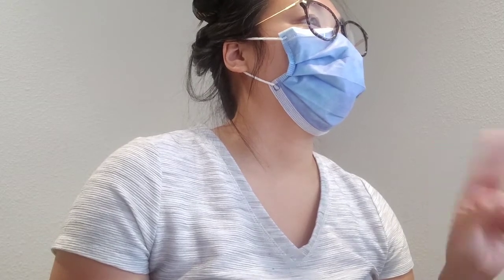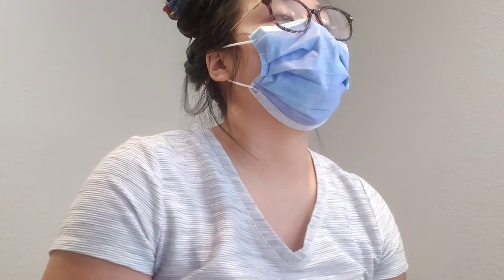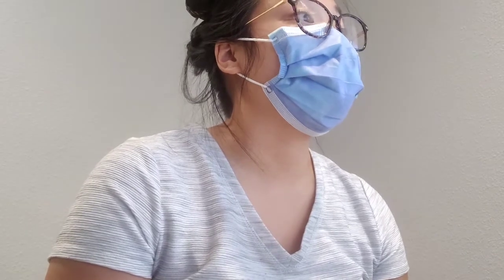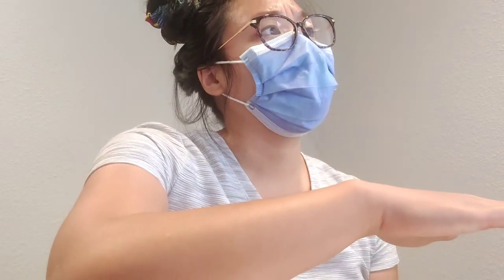Question number 2. When performing a routine CT scan of the neck, which pitch would result in the highest patient dose? So I answered 1.7, and the correct answer is 0.7. In my mind, I was thinking the longer the pitch, because the pitch is how long the patient is going through the table, they would receive more radiation.